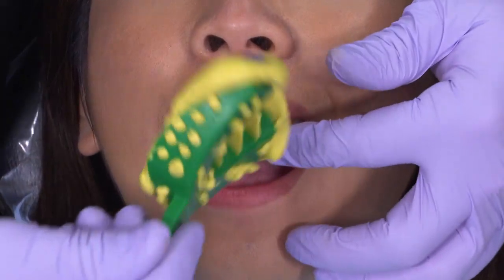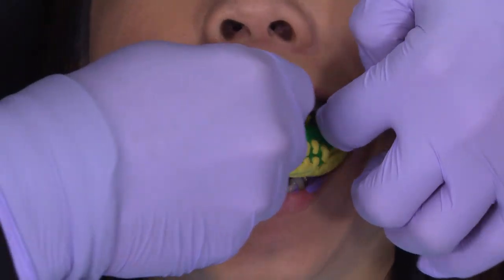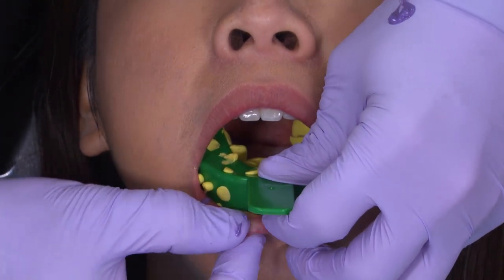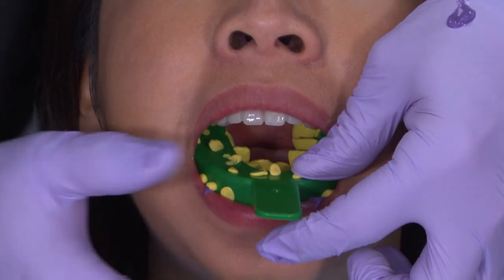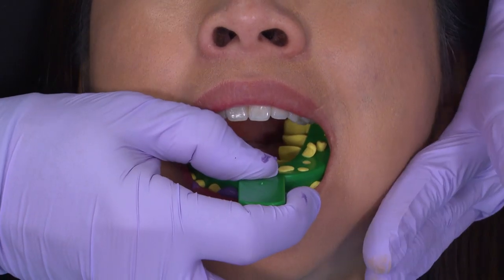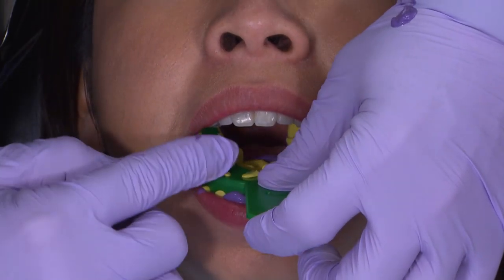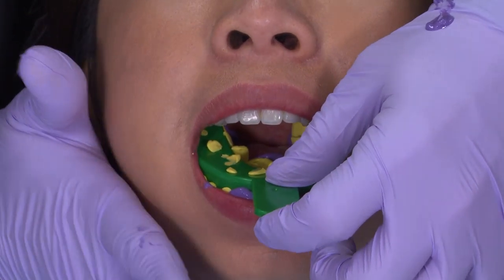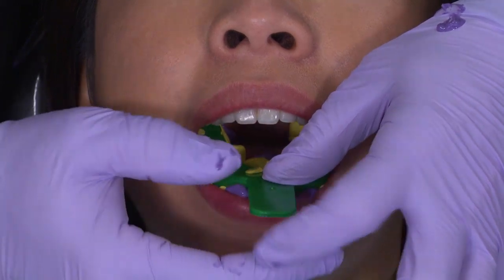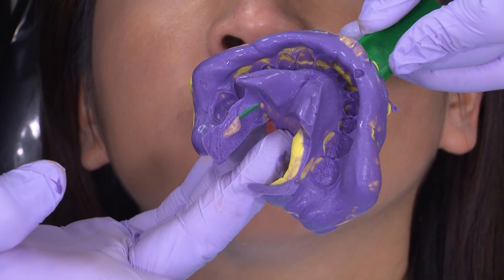This entire assembly is now placed back in the mouth and seated just with hand pressure. I'm gently pressing the chin and the cheek area, and that's going to help to flow the medium body material and remove any air bubbles that may be present. The most important technique requirement at this stage is to make sure that the tray is held in with hand pressure only — don't ask the patient to bite on any props to hold it in place. The impression can be removed after it's set and checked to make sure everything is in order.